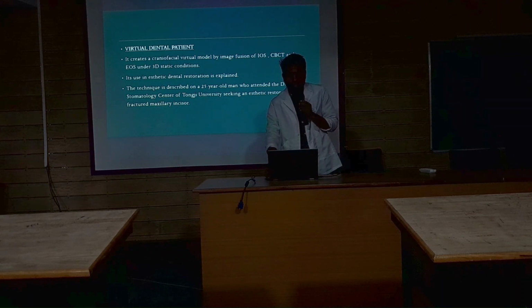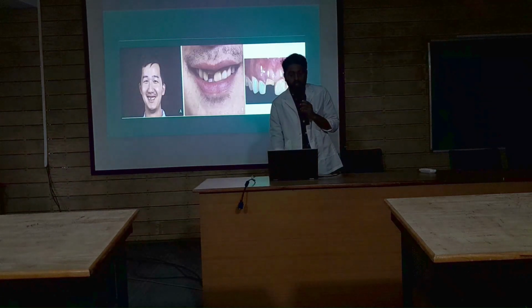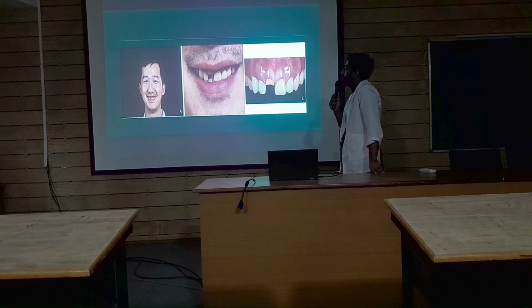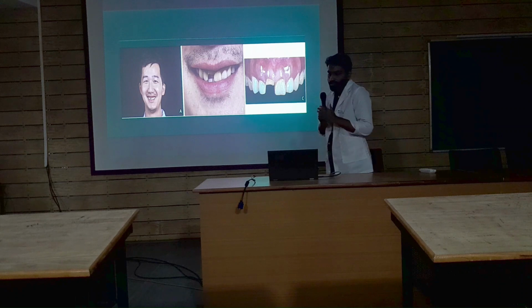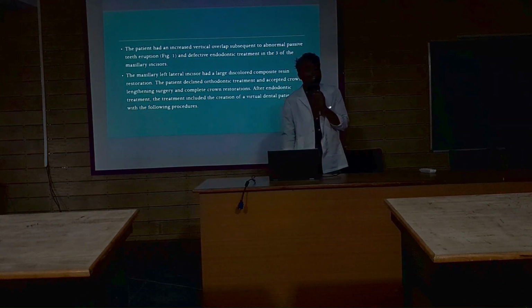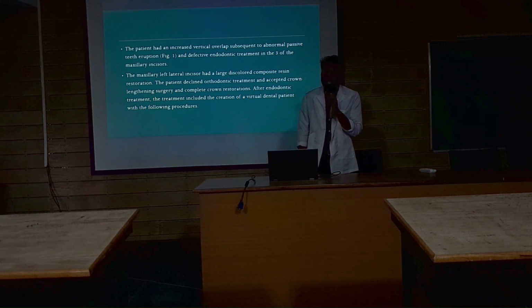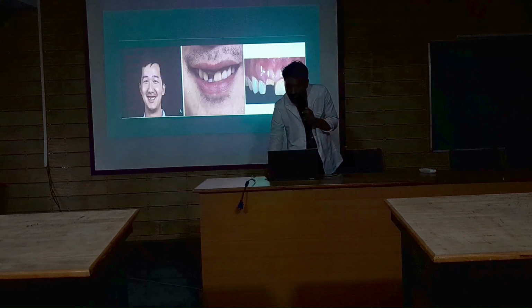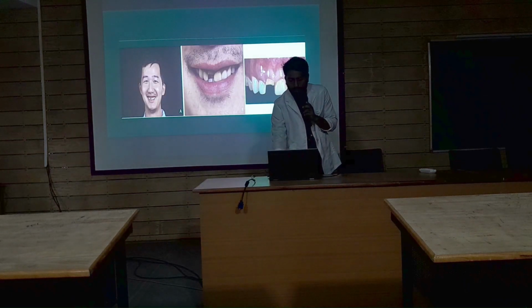It's a technique described on a 25-year-old man who attended the Digital Stomatology Center of Tongji University seeking an aesthetic restoration of a fractured maxillary incisor. So this is the patient. We can see that he has a fractured maxillary incisor. The problem was that the patient had an increased vertical overlap subsequent to abnormal passive tooth eruption. So due to passive tooth eruption, he had an increased vertical overlap.